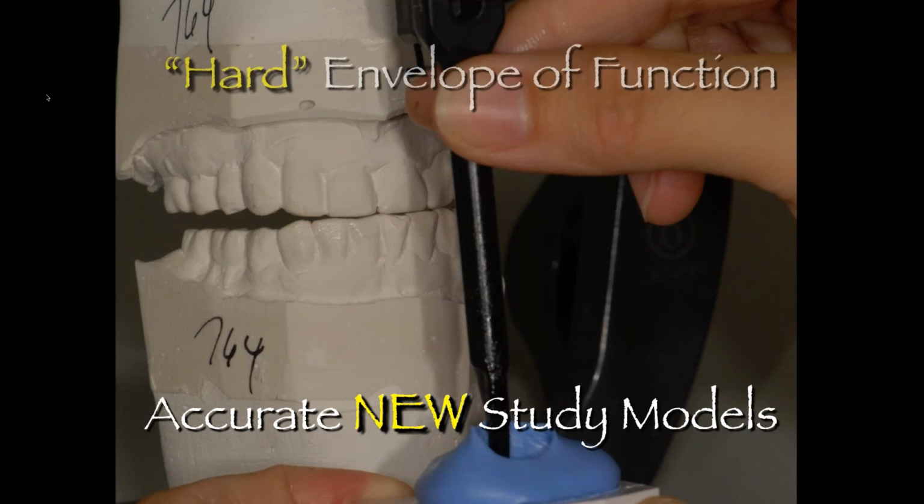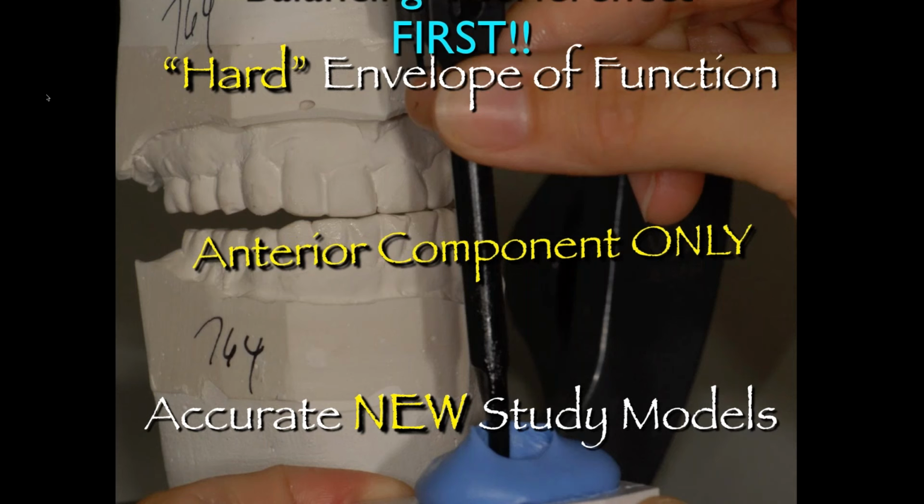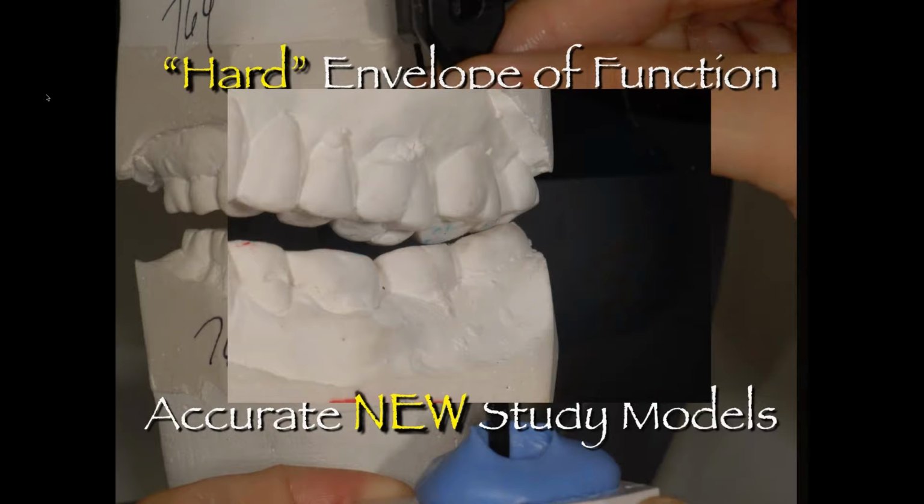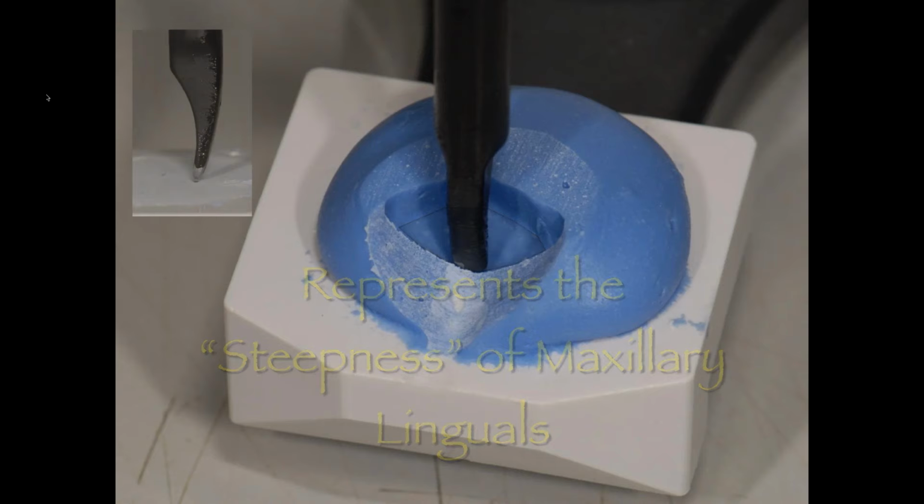So we want to make sure we get fresh models from the doc. We want to make sure that we capture the proper envelope of function, which, of course, remember, is the anterior component only. But you have to make sure you eliminate any balancing interferences first before you make this, or we'll be wrong. So make sure you check your articulator, that you don't have this situation going on, before you make a guide table. And it does represent the steepness of the maxillary linguals. And again, the pin that we use is this pin.